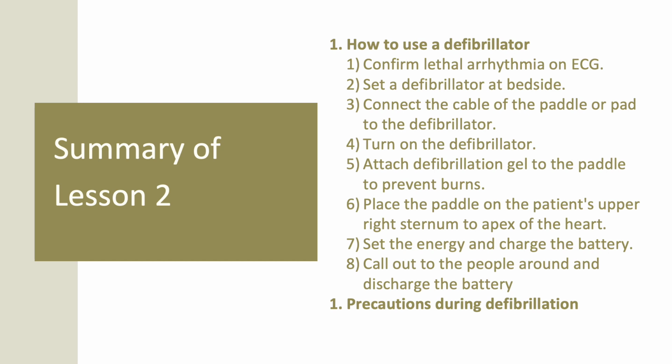This is the end of Lesson 2, How to use a defibrillator. Make sure you've mastered the basics before you move on to the next level.